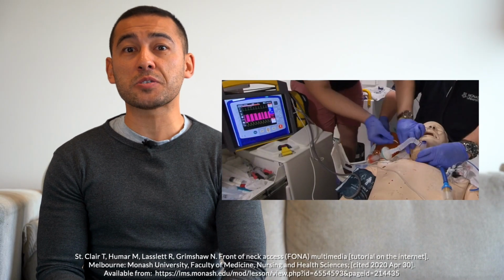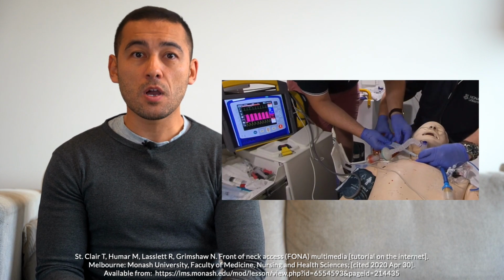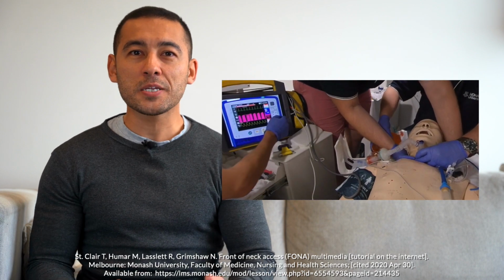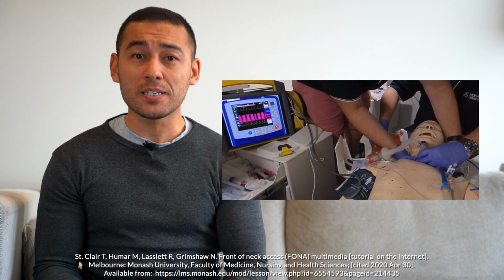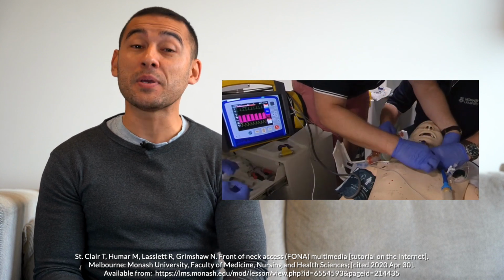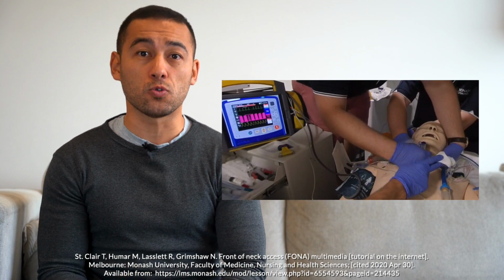Once the device has been secured in place with a foam neck tape, it is time to turn our attention to post-cricothyroidotomy care. One of the first priorities is to commence adequate ventilation and oxygenation. It may seem obvious, but as a patient has foregone effective ventilation and oxygenation for a relatively long period of time, their SpO2 may be unacceptably low, while the end-tidal CO2 may be excessively high. If this is the case, an immediate focus should be directed towards bringing these numbers back to normal.